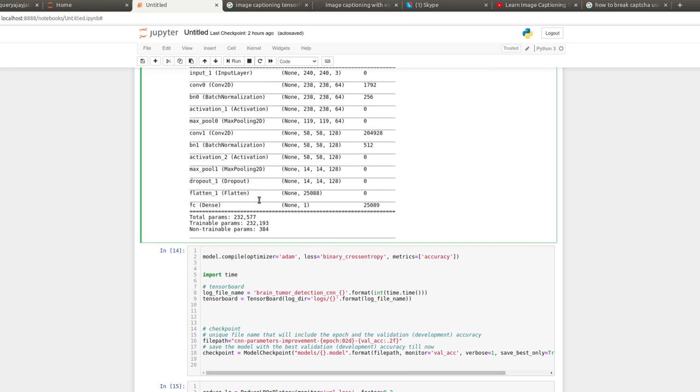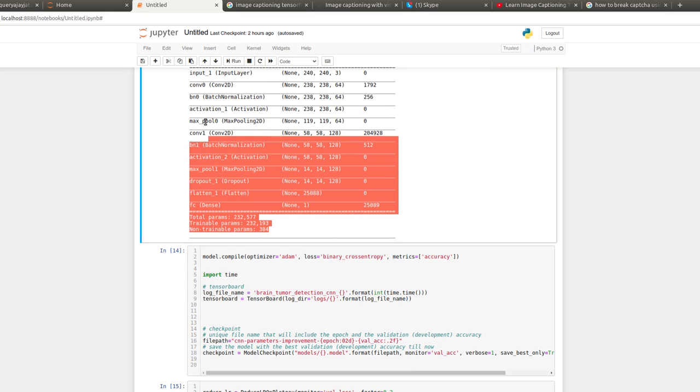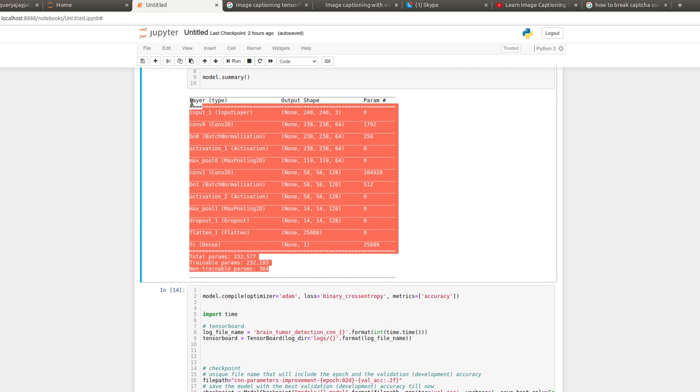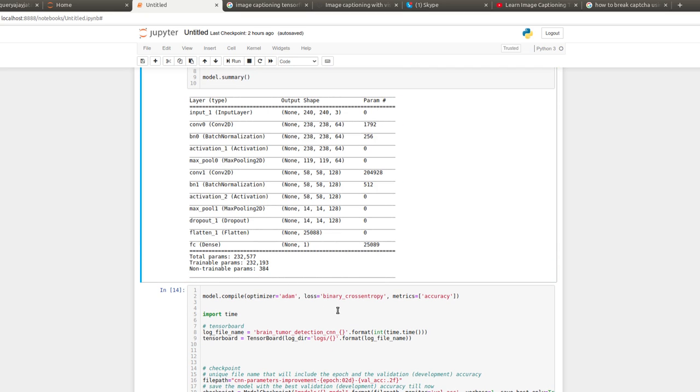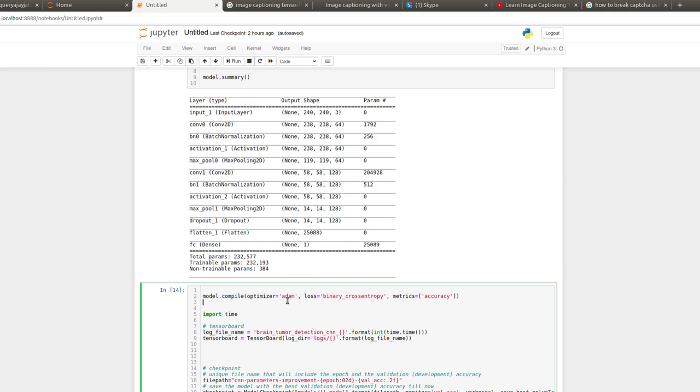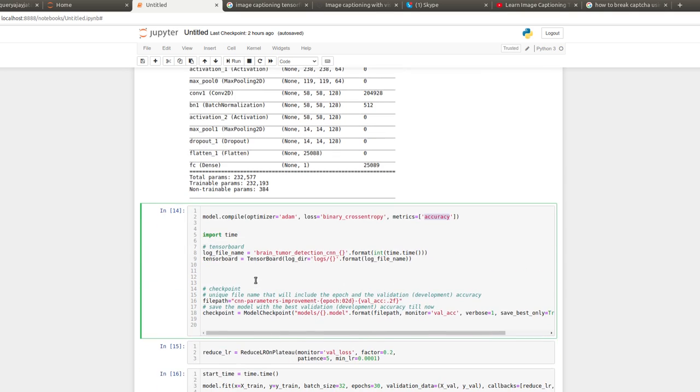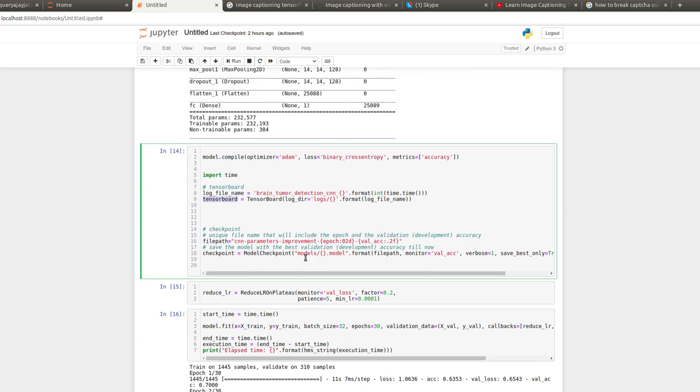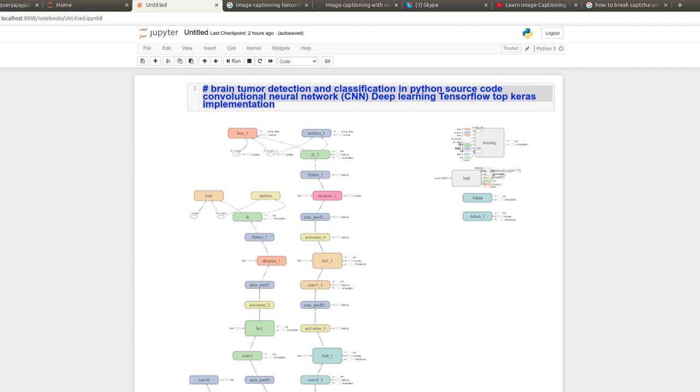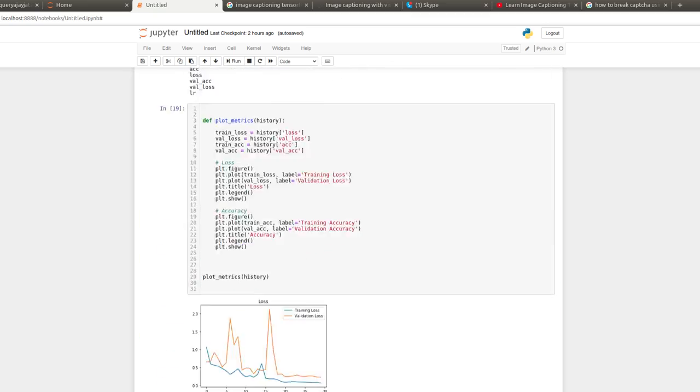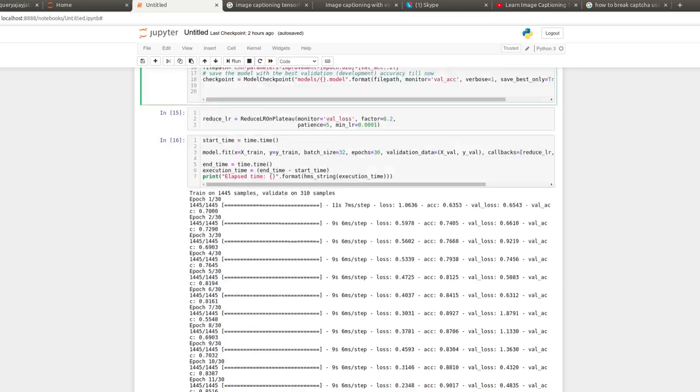All the training performance will be stored in a log file and can be visualized using TensorBoard. The TensorBoard visualized graph you can see at the beginning section of this notebook. Once the model checkpoint is saved, you can start training. Before starting training, I have used variable learning rate. If the model stops converging at any point, the change in learning rate helps it to converge further and achieve maximum accuracy.